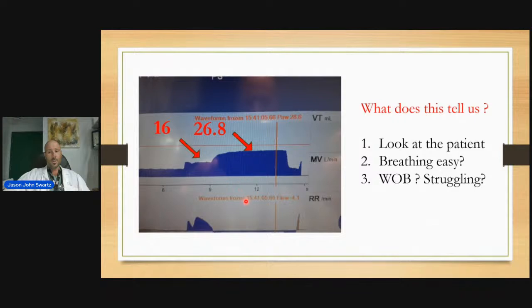Well, let's look at the patient. It's like additional flow and volume on AC/PC. Is he doing it and he looks very comfortable? There's no work of breathing.